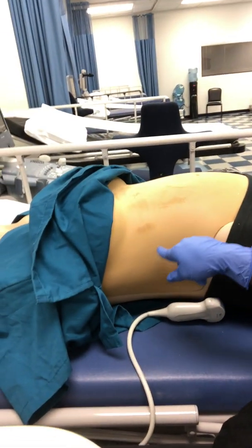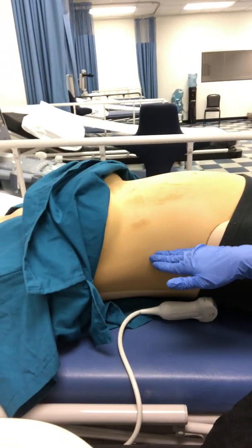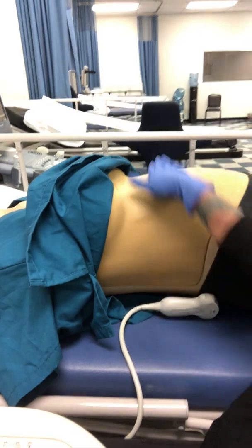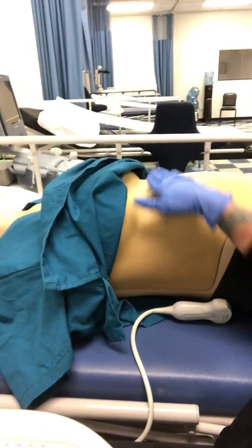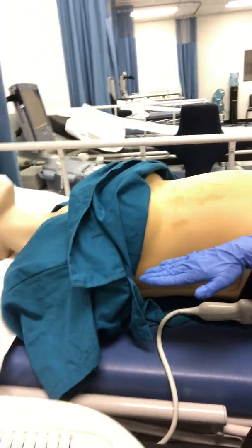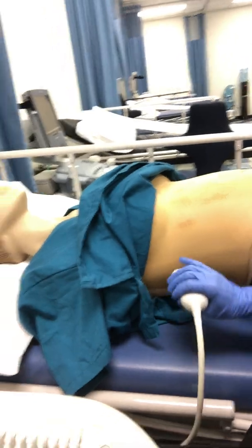So our beam is essentially starting through here, but it's traveling through the body, cutting the body, as if you were to cut this patient right down the center here. It would just go directly into the body. I can't put my hand there, but it doesn't go up and travel around it like I'm demonstrating with my hand. But again, the beam travels from lateral to medial in the coronal aspect.